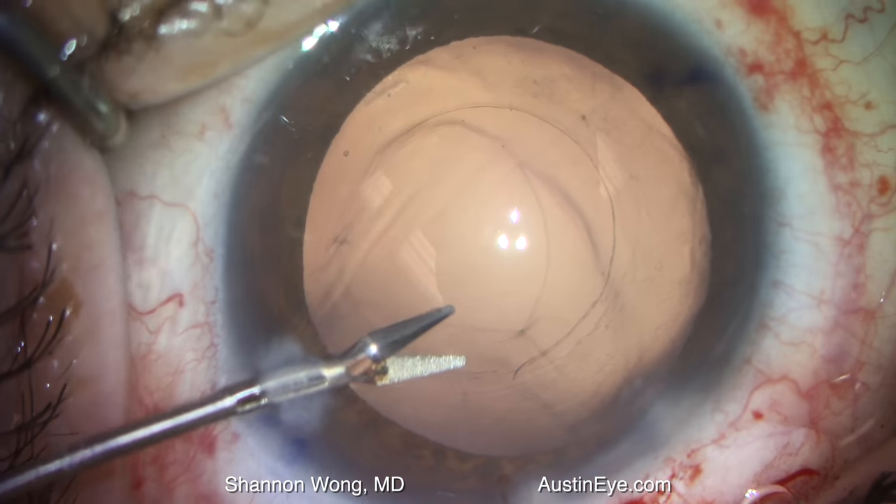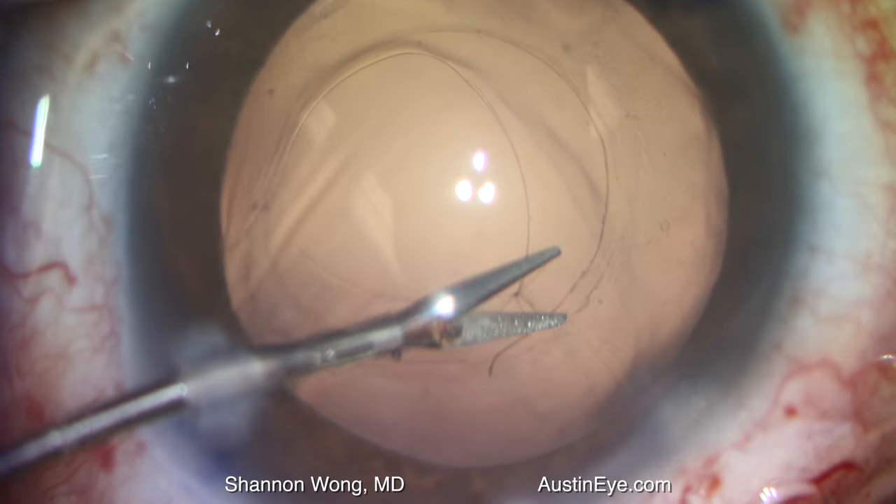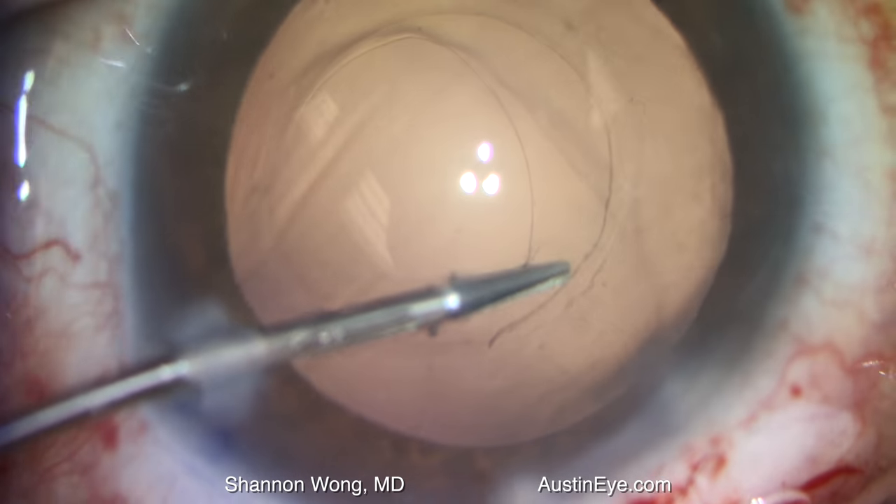There is a small strand of vitreous that we try to trim with MST micro scissors. However, in the process, we barely nick the anterior capsule, which you'll see here.